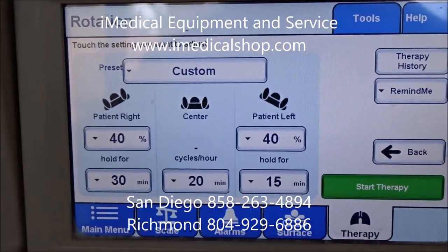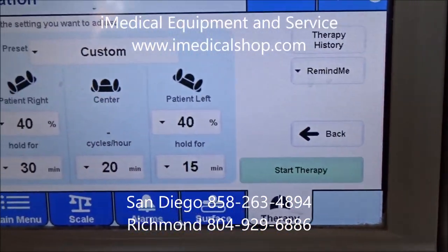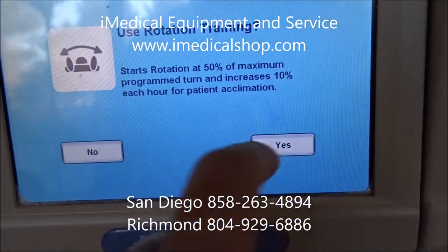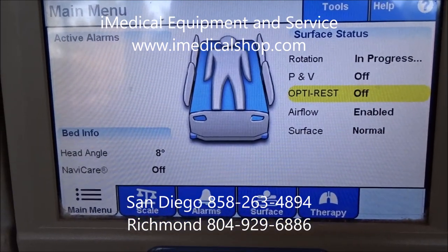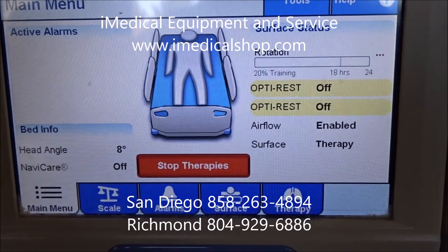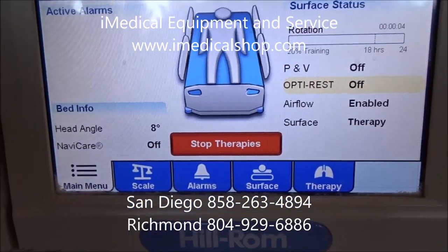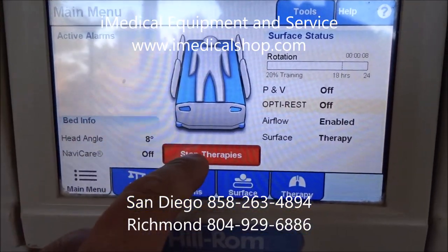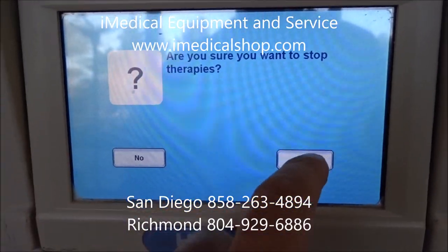To start the rotation process, just hit start therapy. It's a very simple process. You can see it's in progress and now the rotation has started. At any time you want to stop, just come in here and click stop — it's really that easy.